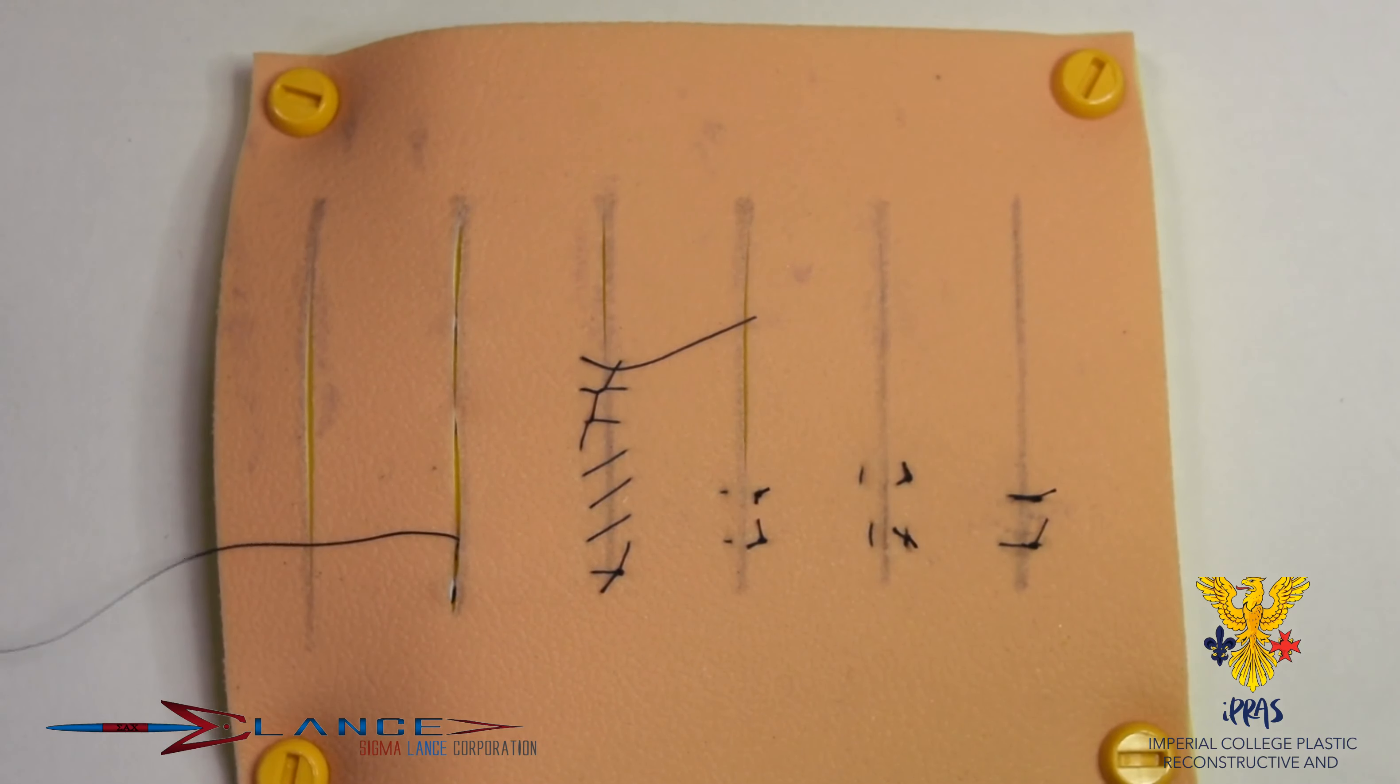Now, the key thing here, the thing that often I get asked is, well, where do you put the next stitch, where should the next stitch sit?